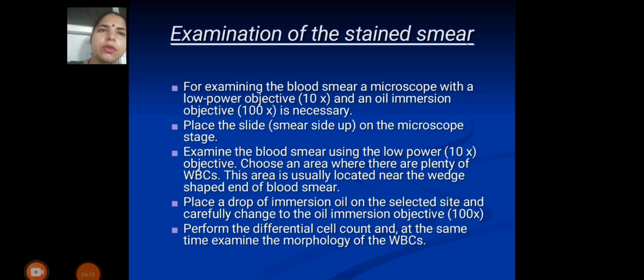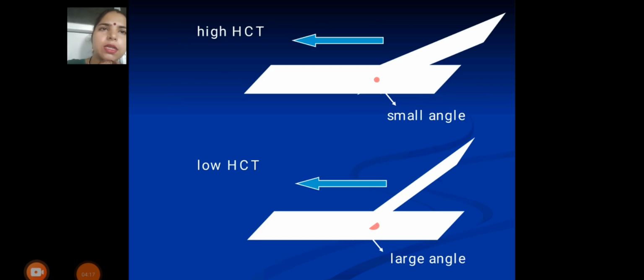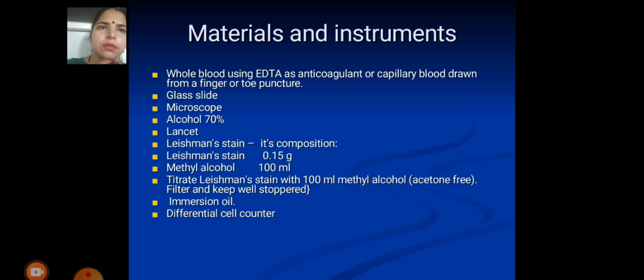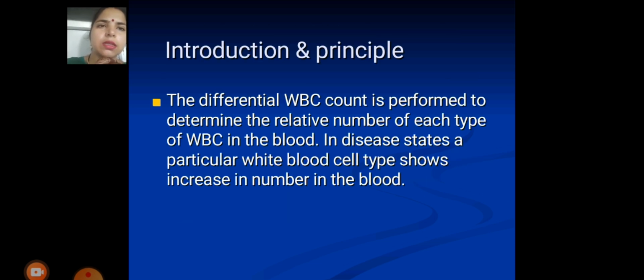In today's class, I discussed the staining of the smear and how to prepare the blood smear, along with the material and instruments, method, and principle.